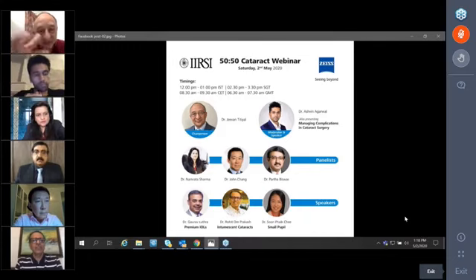So this increases the size as well and decreases the chance of phimosis. It was published in JCRS almost 15 years back. We had not even drawn a schematic diagram for this to show it, but that's a very good concept. It enlarges the rhexis size and decreases the phimosis because you break the circle.